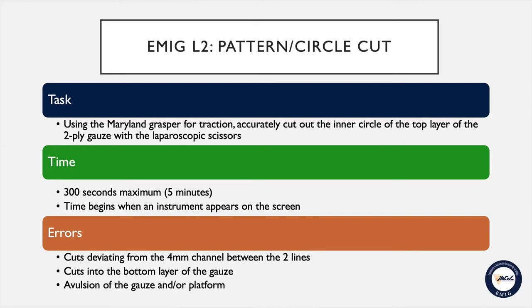Time will begin when an instrument appears on the screen. Errors will include any cuts deviating from the four millimeter channel between the two lines on the gauze.